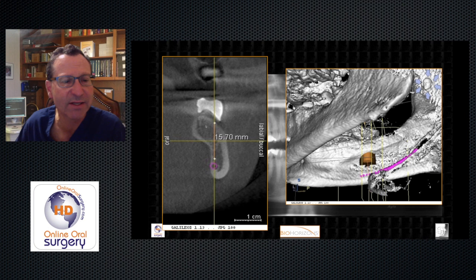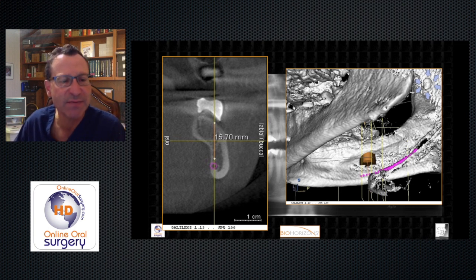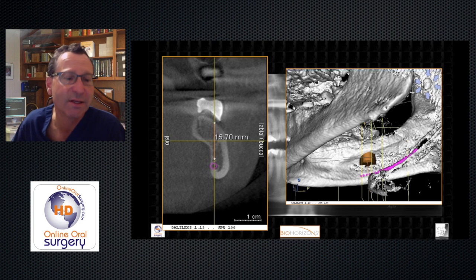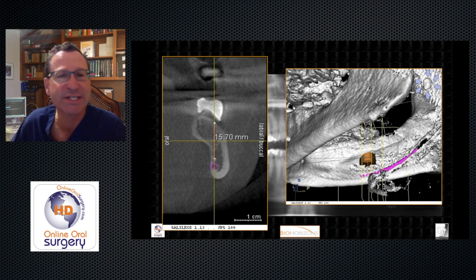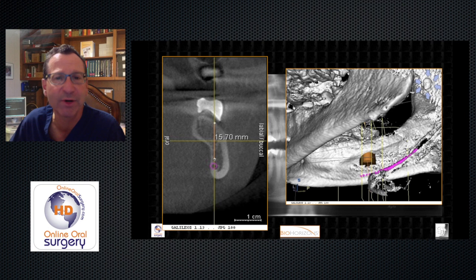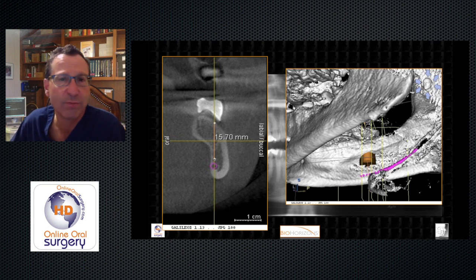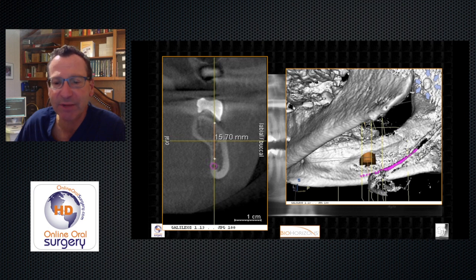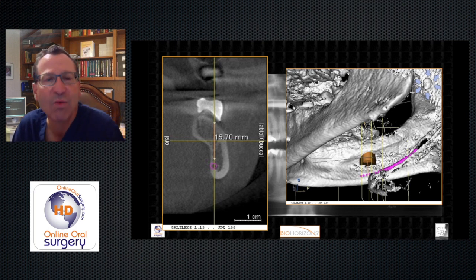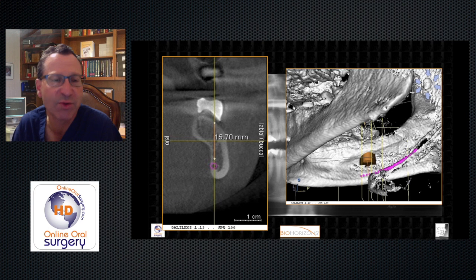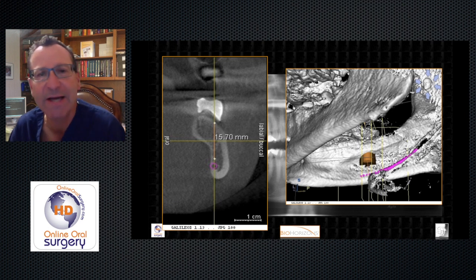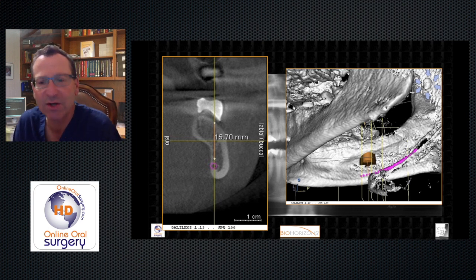I then got a cone beam in my office and decided to use 3D imaging for treatment planning this case. Sure enough, looking at the cross-sectional image, even though it looks like 15 to 16.5 millimeters of space was available and a 13-millimeter implant should be fine, if I had placed a 13-millimeter implant, it would have perforated through the lingual cortex of the mandible.